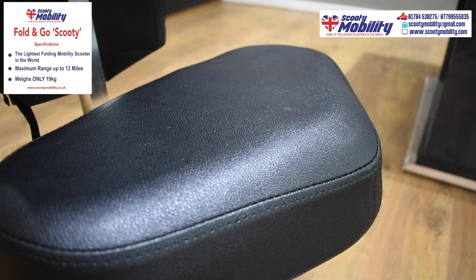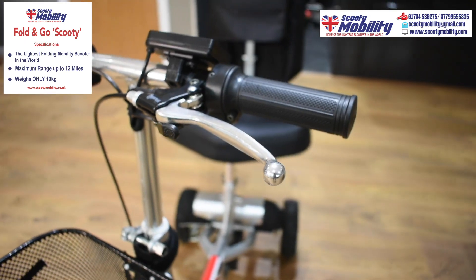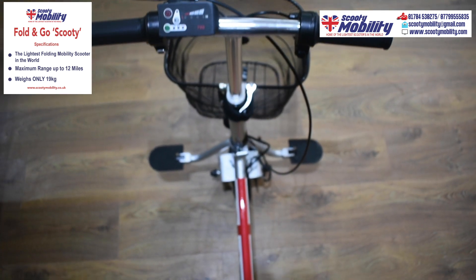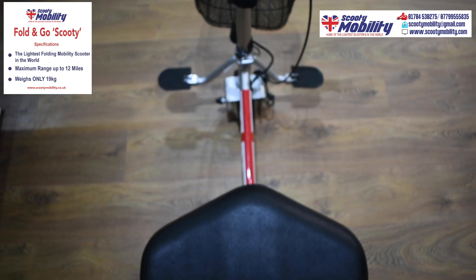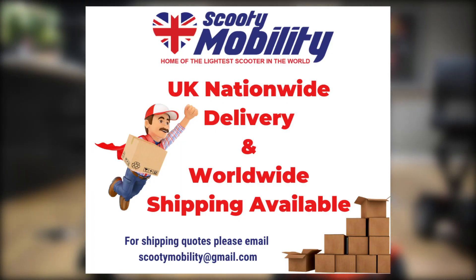It has a nice comfortable high back seat, a twist grip and a manual braking system, just like on a bicycle really. This scooter is a British design, sold by a British company. It's unique to us at Scooty Mobility.